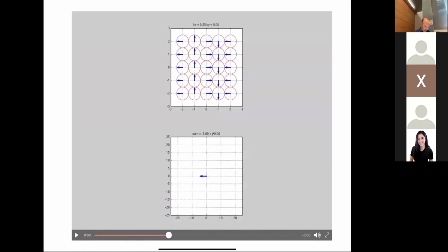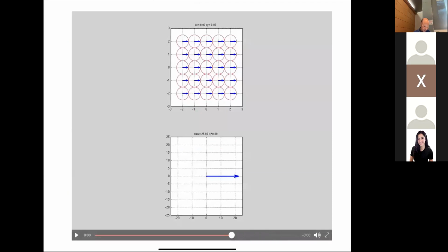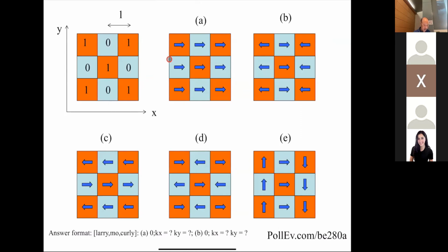Basically, the main thing is, as I go to different spatial patterns, the summation is very small. Sorry, I need to slow down this movie. Maybe for next year we'll do that. Anyways, the idea is that the spatial pattern only really matches when it's at kx equals 0. Here, this might be a better example. Now I've got a stripy object, so I would expect it to be bigger. Sorry about this. We'll have to fix that next year. Anyways, let's do this exercise together.